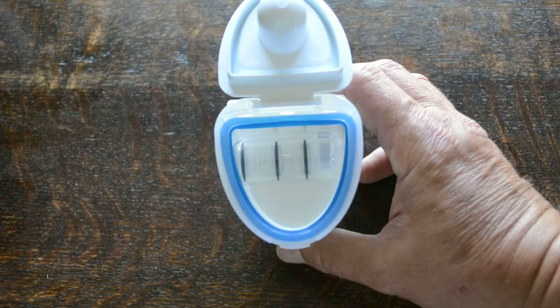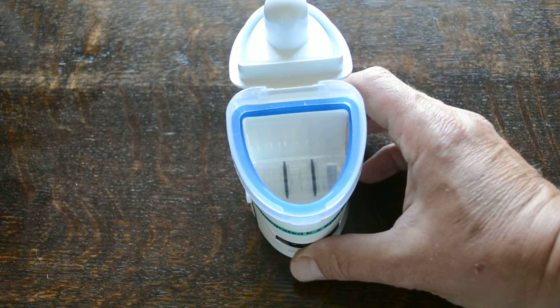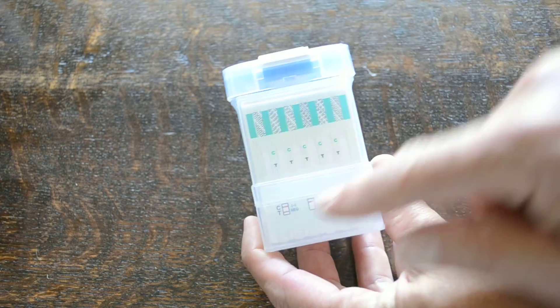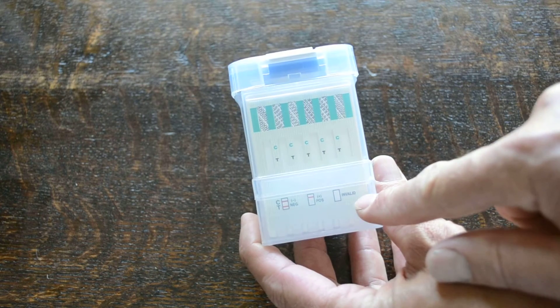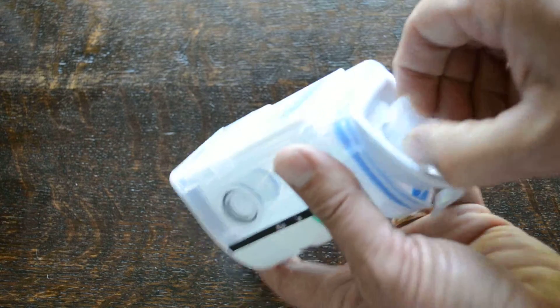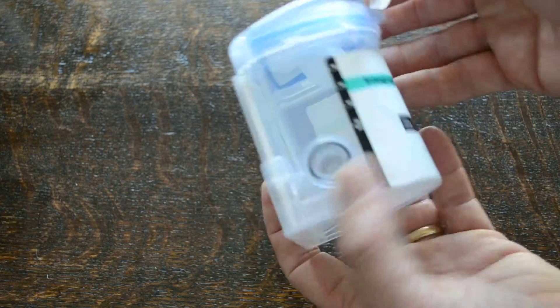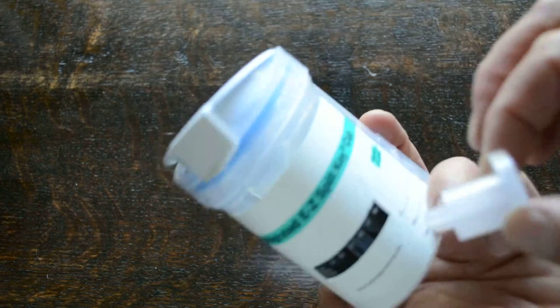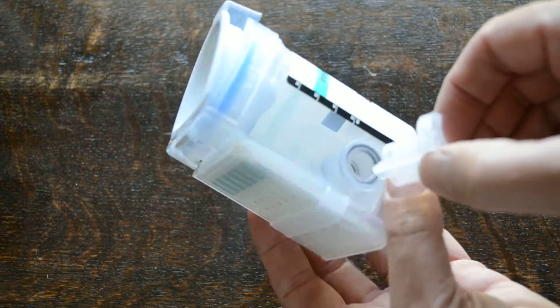With this design, the collection chamber is completely separate from the chamber where the urine is then allowed through to have contact with the test membranes, which you can see along the base here. The key system is located in the lid, and to run the test the key has to be applied into the chamber lock.